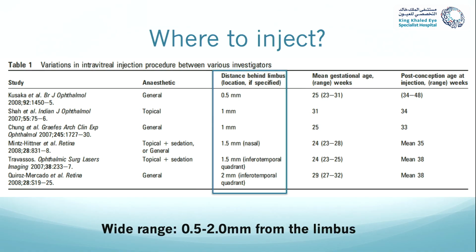When I was looking at the publications, I started asking people why there would be such big variations. Then I realized that different people writing different articles have different interests. From a retina person's view, I want to protect the retina, so I do not want to enter into the retina at all. Those people using a shorter distance are usually retina surgeons.